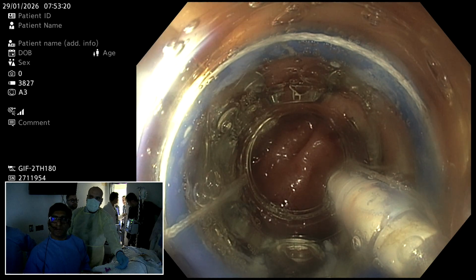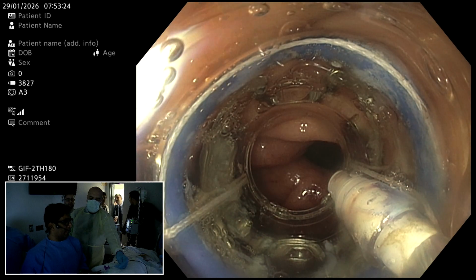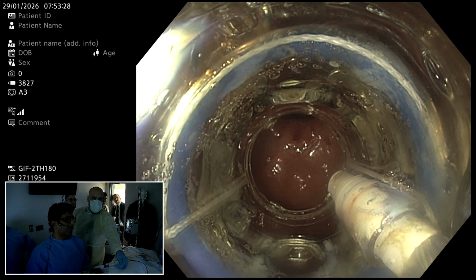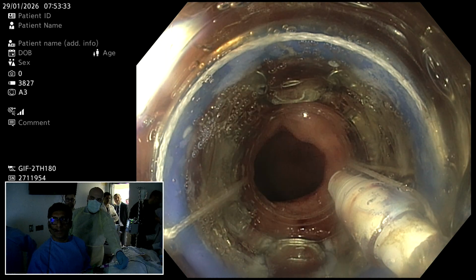This is the case of duodenal neuroendocrine tumor. Do we have the history slides? Okay, so this is a case of a duodenal neuroendocrine tumor which is located on the posterior wall.